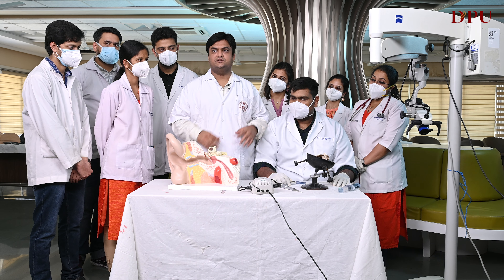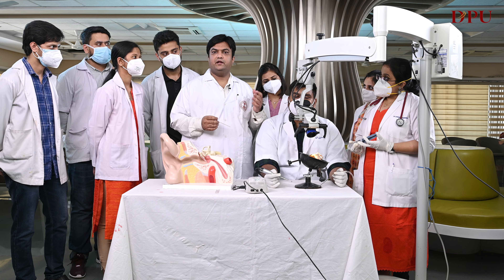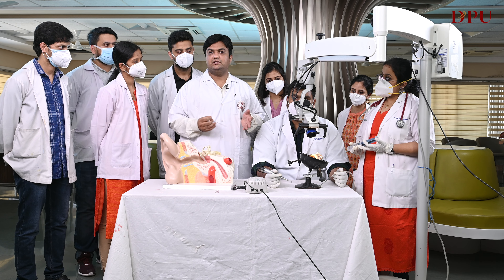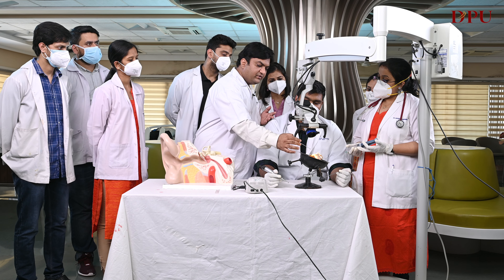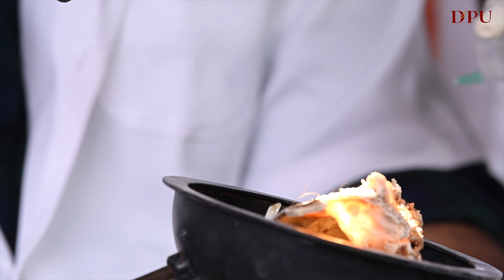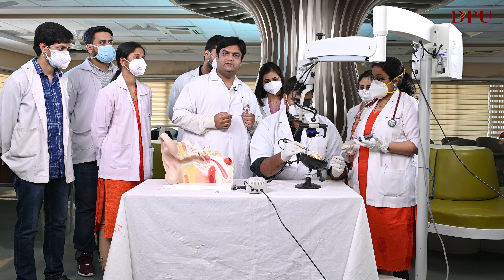Coming to the temporal bone dissection — in our labs, we ask our residents to train on human anatomical bones, which are thankfully provided to us by our anatomy department. After a posterior approach, once the bone is exposed, we identify the spine of Henle, identify Macewan's triangle, and start drilling over it. As you can see, one of our residents will be drilling over Macewan's triangle.